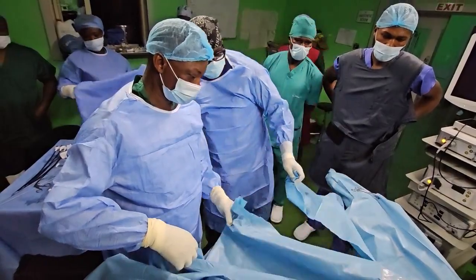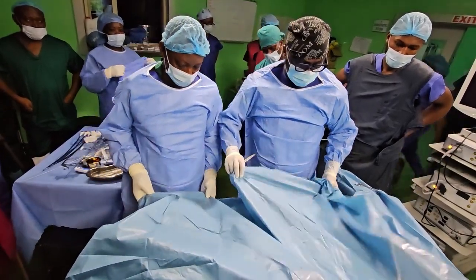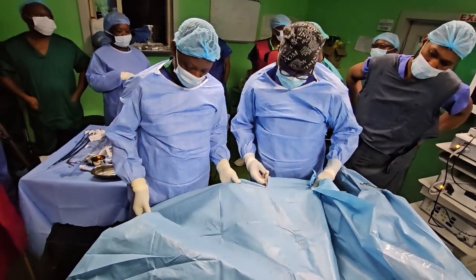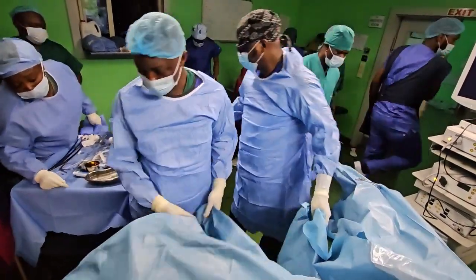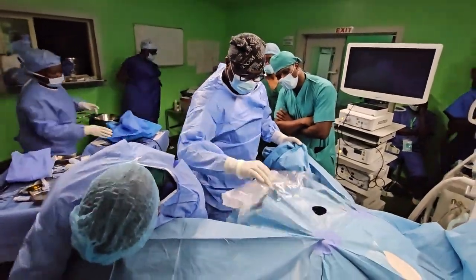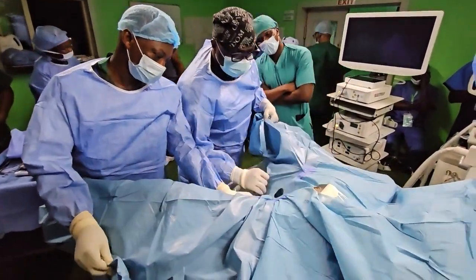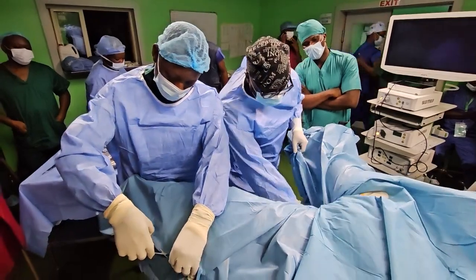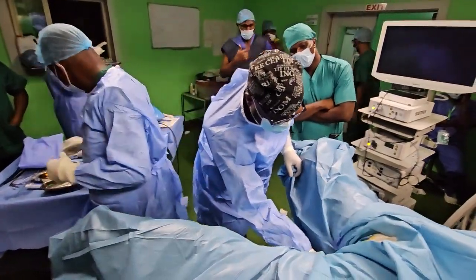I usually cut this so that it can go, so that you can have enough room. So this usually drops. This will drop. So see what I was saying. It follows through.